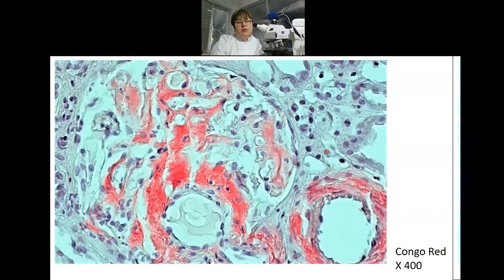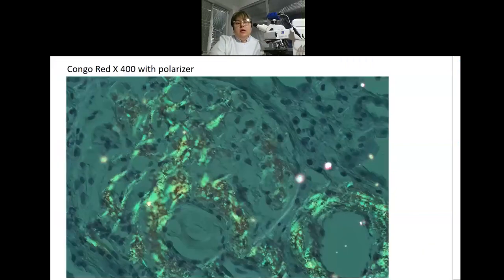This is Congo red stain for amyloid. We use this stain in patients who are older than 40 years. Also, in cases when we do not see any significant changes by light microscopy, we use Congo red stain in younger patients as well. You can see red discoloration in different structures. The same Congo red stain under polarization microscope — polarization allows us to reveal small amounts of amyloid deposits and helps us make the diagnosis.